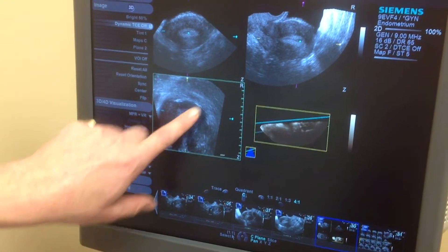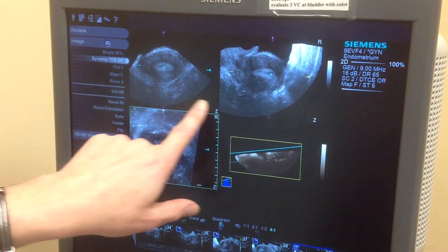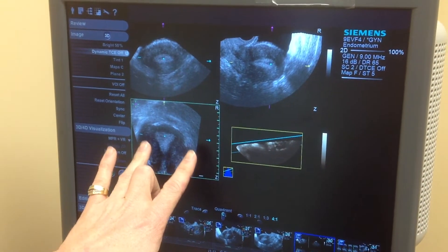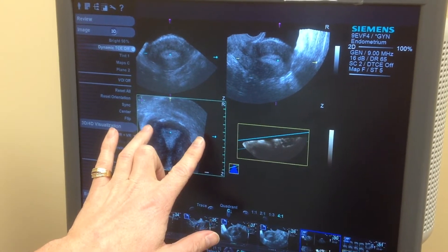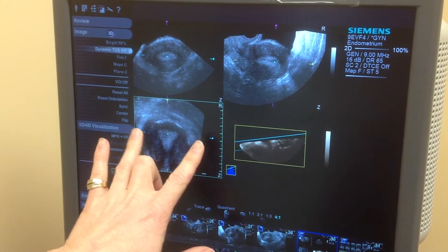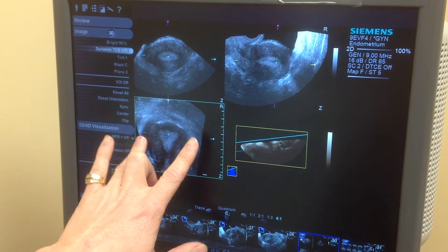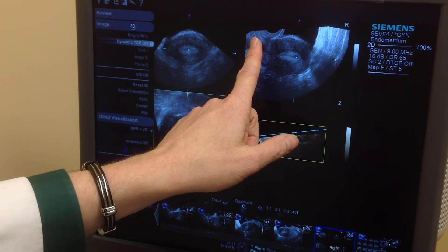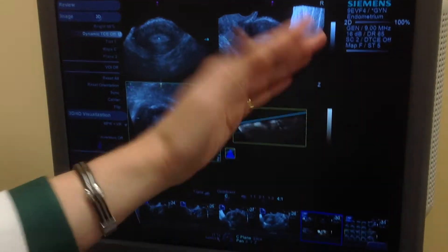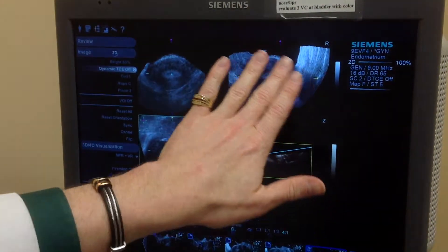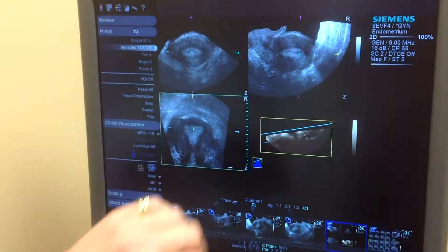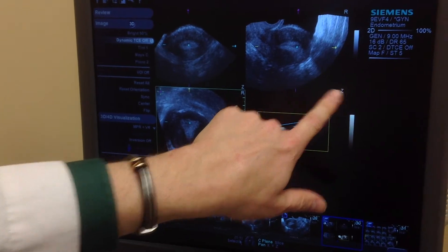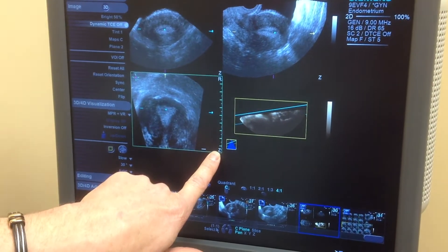A few things about the display indicators here: we're in pan function and active mode. The R just means that this image is reversed — normally it would be right side, left side, but now it's left side, right side. The same R appears in other quadrants. That's because during rendering, when I change one plane, all the other planes change accordingly since they're all connected. The Z just means that they're zoomed up with the zoom control.